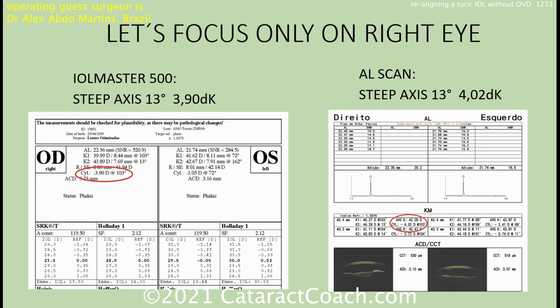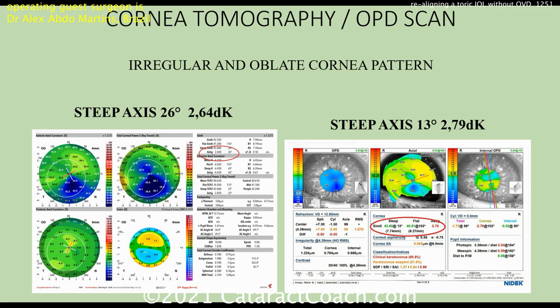The IOL Master says it's 3.9 diopters, and the axial length machine has measured about four diopters. Both say 13 degrees — that's pretty consistent for the steep axis. A tomography OPD scan is pretty similar. The topography says the axis is 26 degrees; the NIDEC OPD scan says 13. So we're pretty similar across these devices.